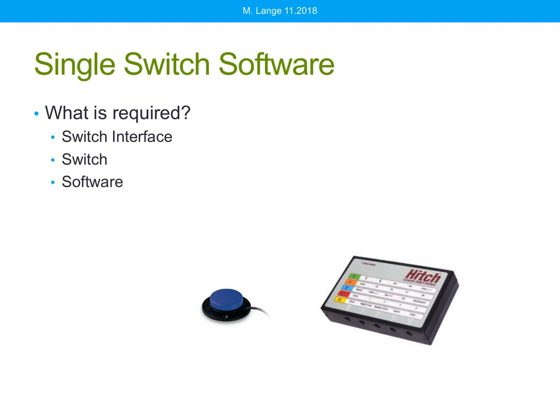So what's required to make this work? Well, generally we need some type of switch interface that attaches to the computer. We then need the switch that's most appropriate for that individual client at their best placement. And finally, we need the software to work on these scanning skills.